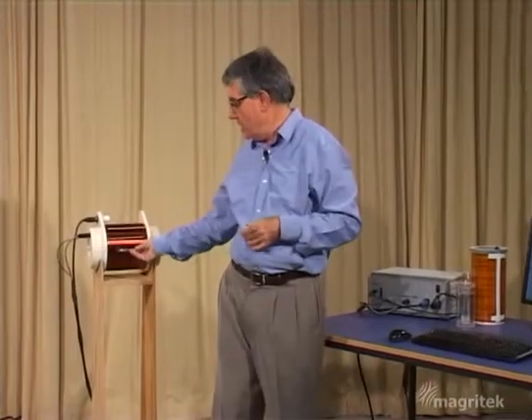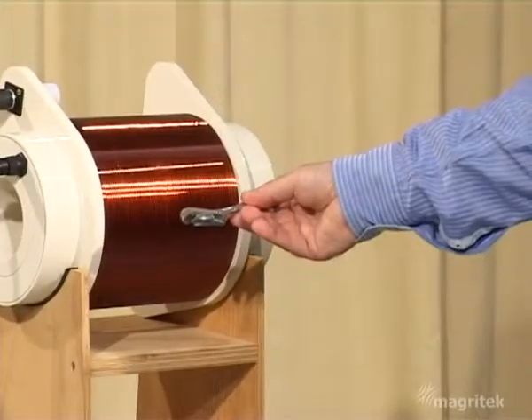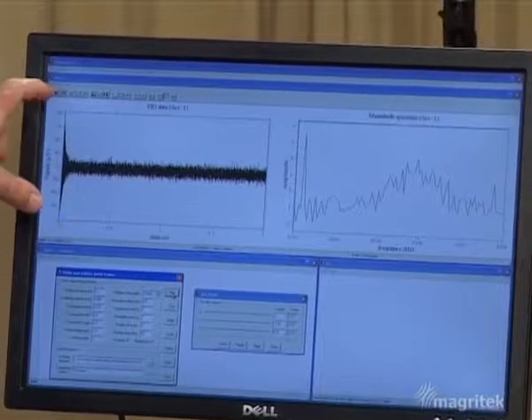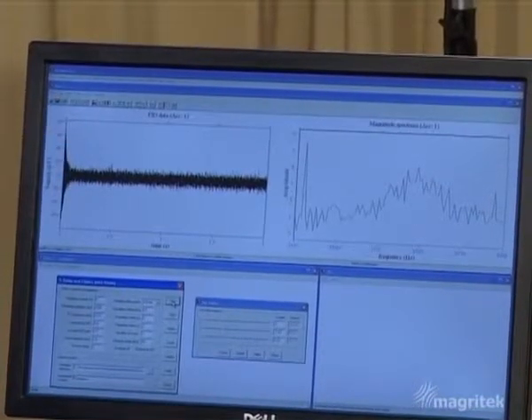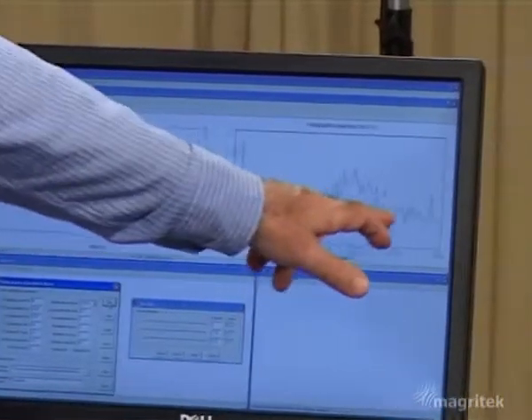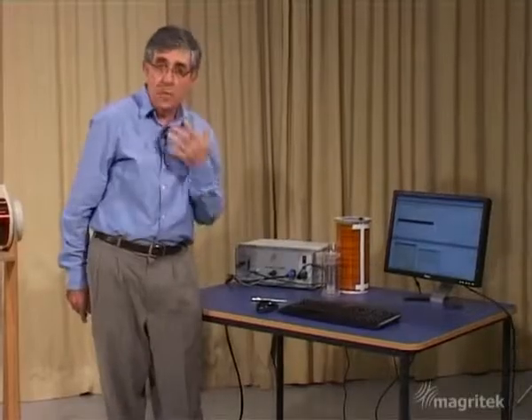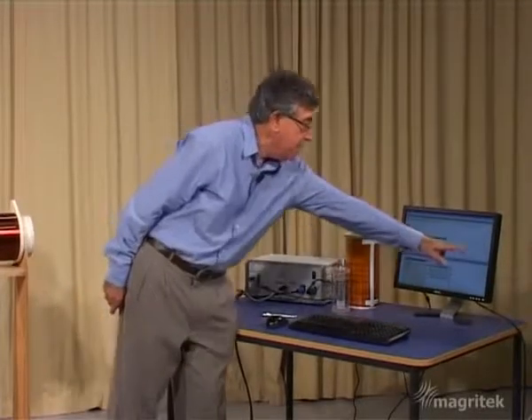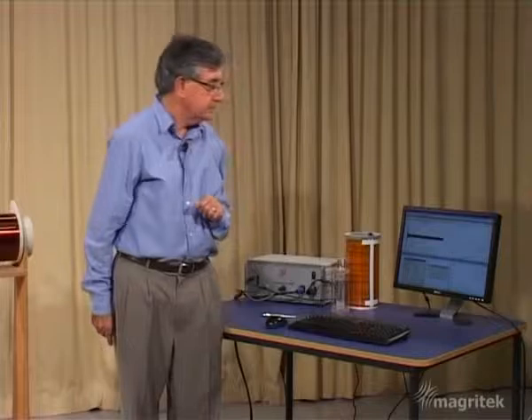Pre-polarizing pulses on now, hold the spanner there, and here's the free induction decay. Look at that, it's very rapid indeed, and it's led to a very, very broad spectrum. So by perturbing the homogeneity of the field quite severely with this crescent spanner, we produced a much more rapid decay and a much broader spectrum.